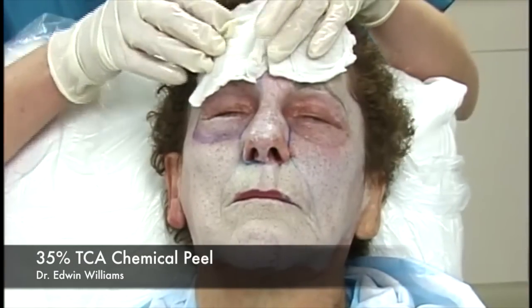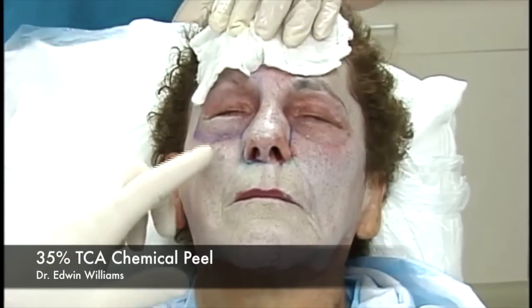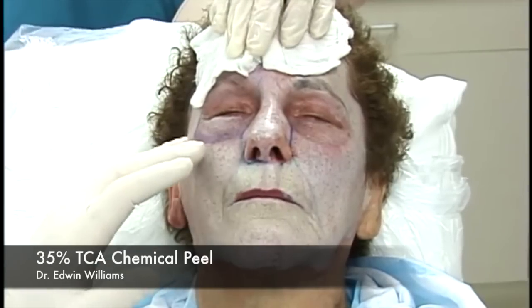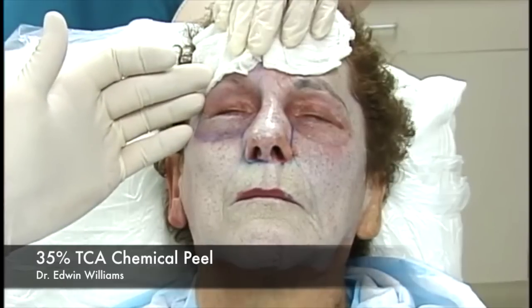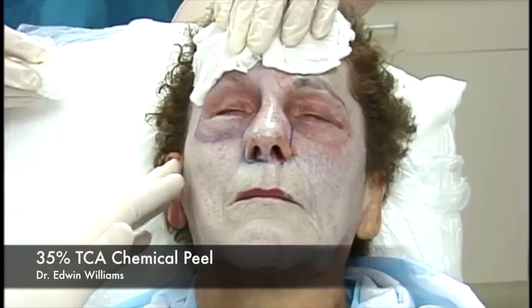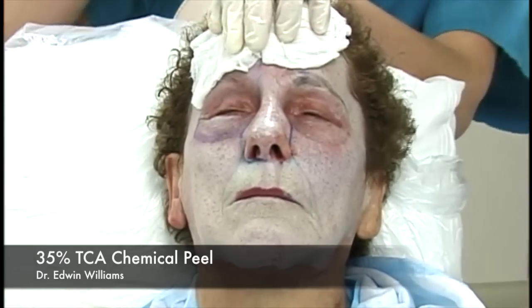Two additional points: First, the frosting in the periorbital area starts to dissipate after application—it would be easy to over-treat by thinking you haven't reached a sufficient frost. It begins to frost, then dissipates, becoming erythematous and looking like windburn. That's why it's so important to mark out your aesthetic units and work within each unit before moving on to the next.